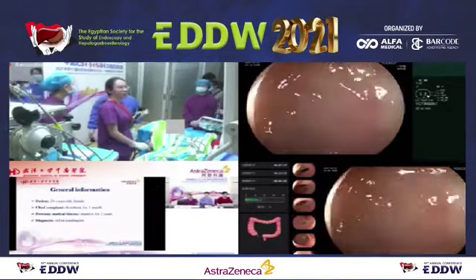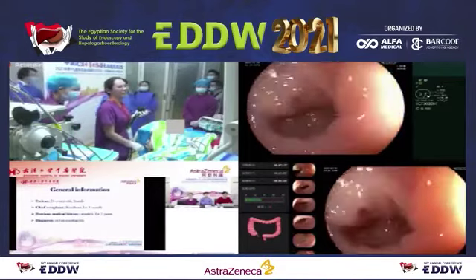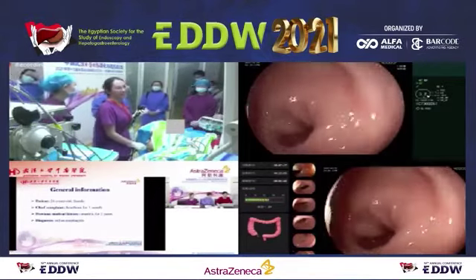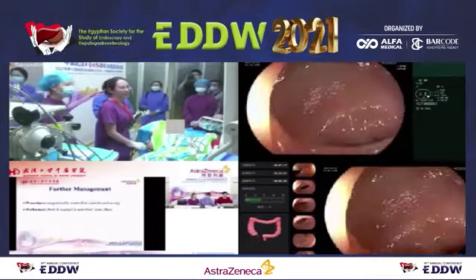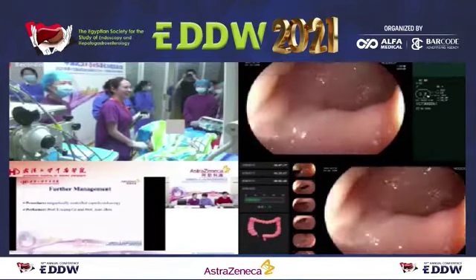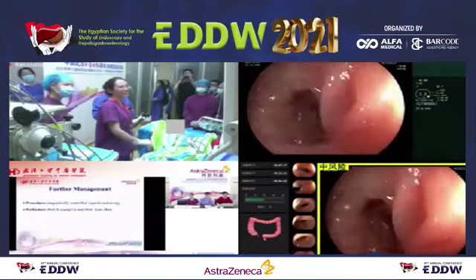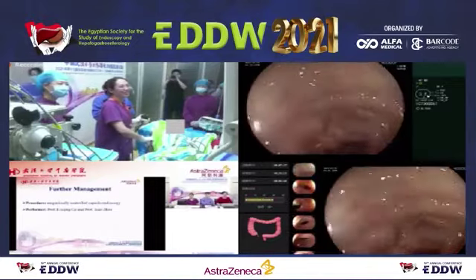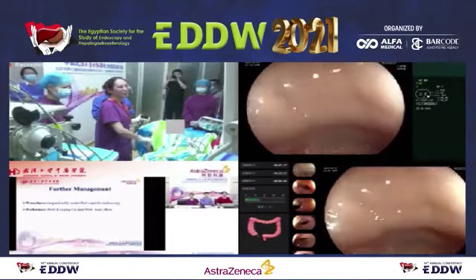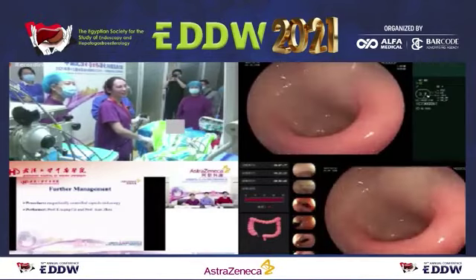Case number 4. This is a 34-year-old female patient. Chief complaint is heartburn for 1 month. Previous medical history: mastitis for 2 years. The diagnosis is reflux esophagitis. We will do magnetically controlled capsule endoscopy, and it will be performed by Professor Liu Qingge and Professor Juan Zhou.